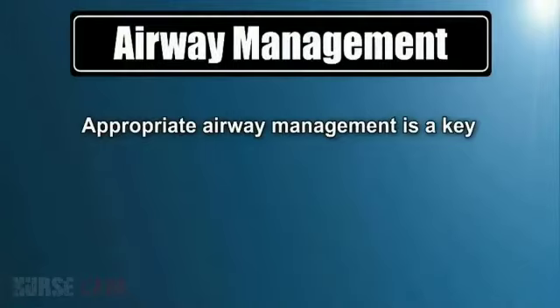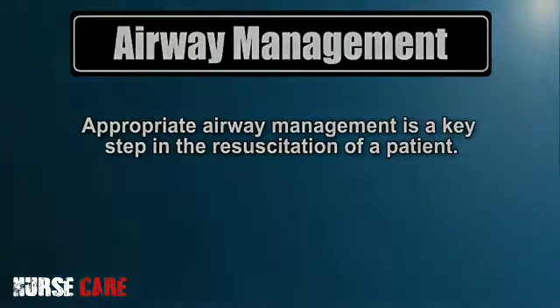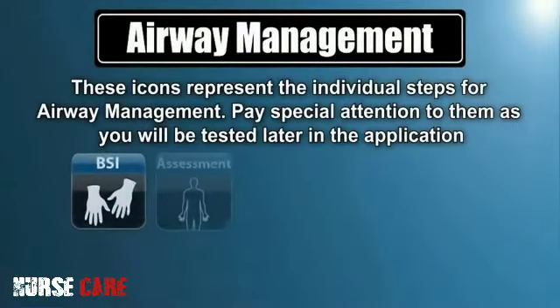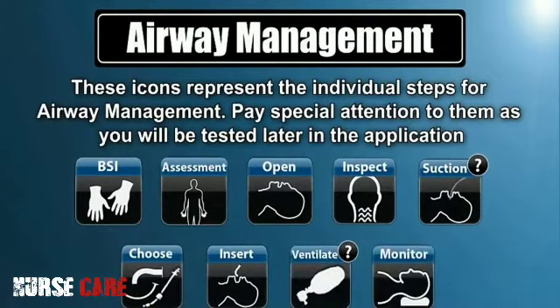Appropriate airway management is a key step in the resuscitation of a patient. These icons represent the individual steps for airway management. Pay special attention to them.